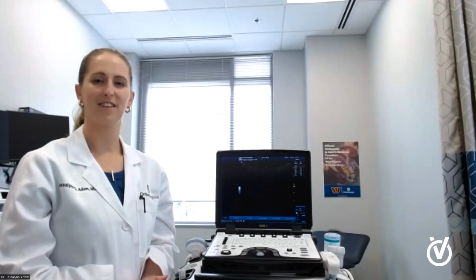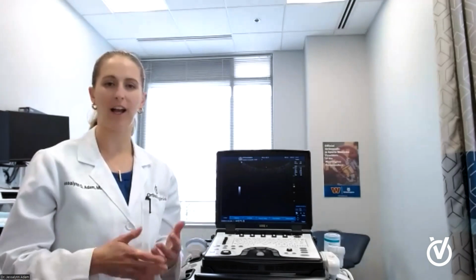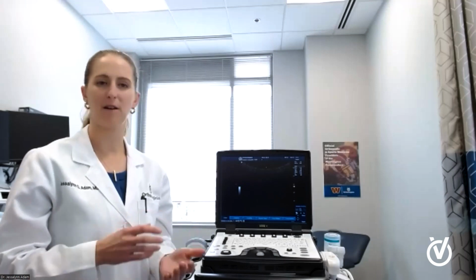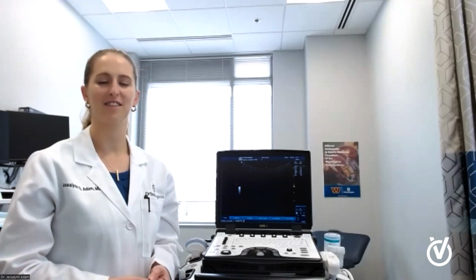Thank you. Is there any hurt or discomfort from the ultrasound? No, generally not. If, for instance, I've scanned over an area maybe where someone had a cut and we need to evaluate if the tendon is intact, there may be some discomfort if I'm pushing over an injured area, but I try to be as gentle as possible. And for the most part, it is relatively painless.